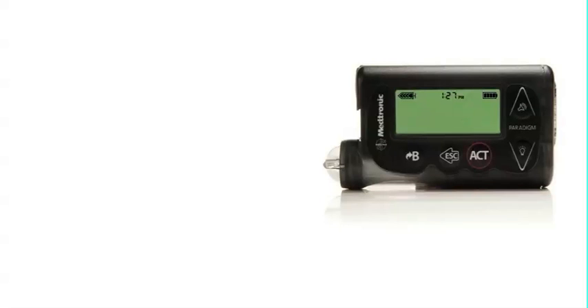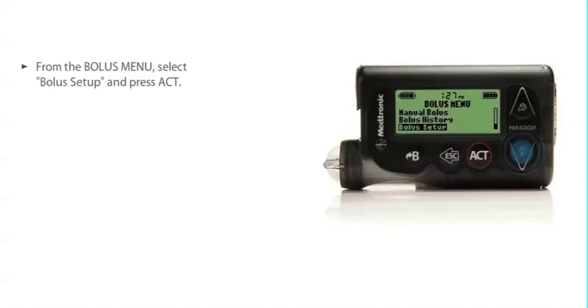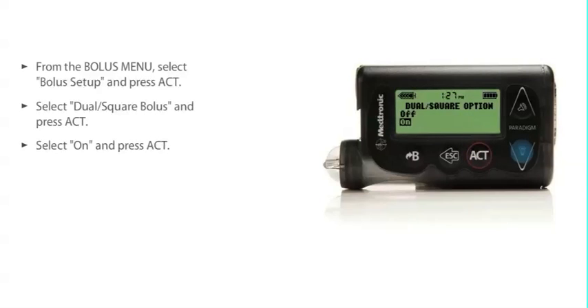If you want to practice using this feature, the first step is to turn on the dual wave square wave bolus option. In the bolus menu, select bolus setup and press act. Then scroll down the bolus setup menu to select dual square bolus and press act. Now select on and press act again. The feature is now on.